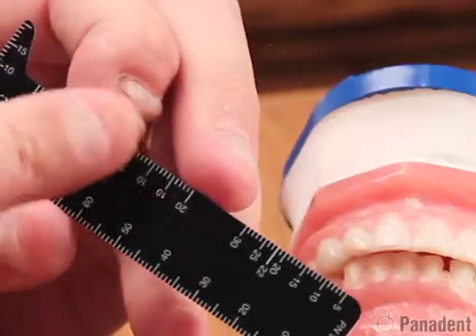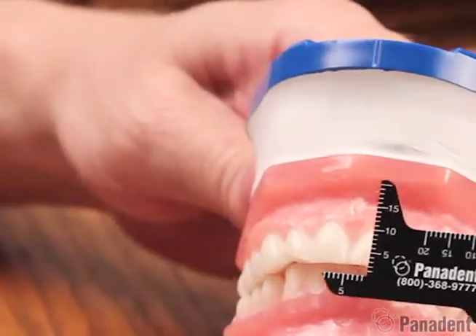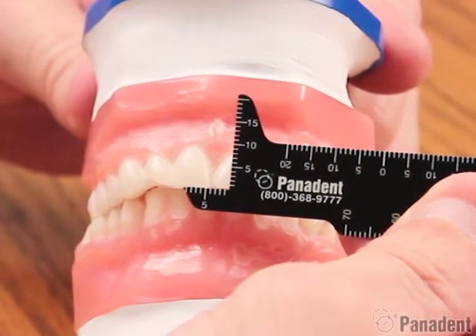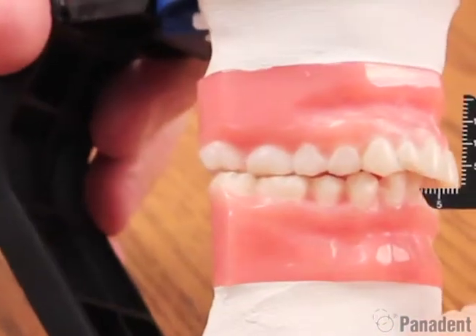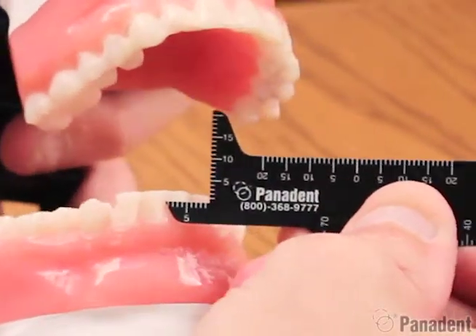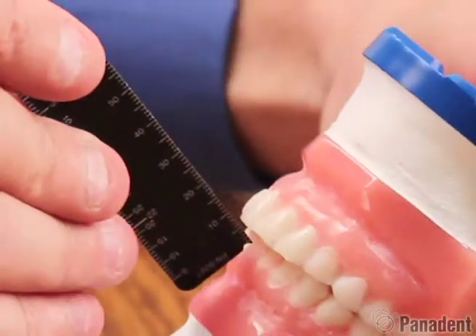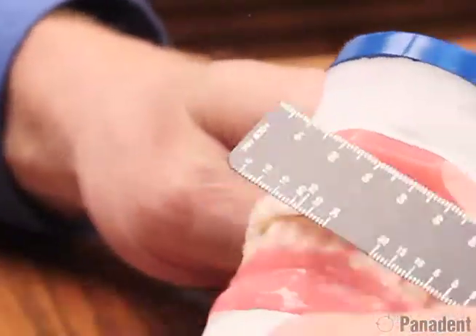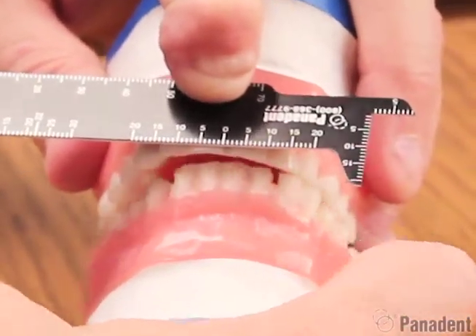The multi-measuring ruler has many scales on it to help us measure different dimensions. We can use this to help measure tooth widths as well as tooth lengths. You can also measure CEJs to CEJs. It has a horizontal overbite scale, and then we can index that to measure vertical overbite. It also has a little notch here at the bottom that we can use to notch onto the lower incisor for opening range of motion. There's a horizontal scale built into it as well so we can evaluate horizontal range of motion.